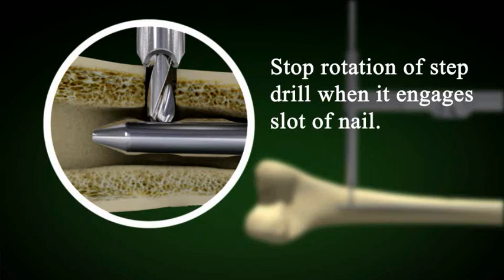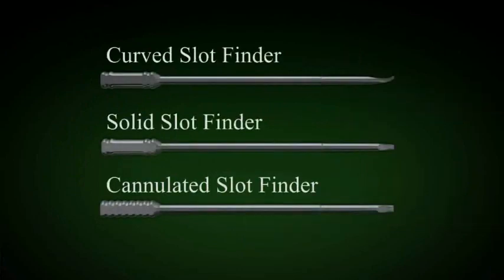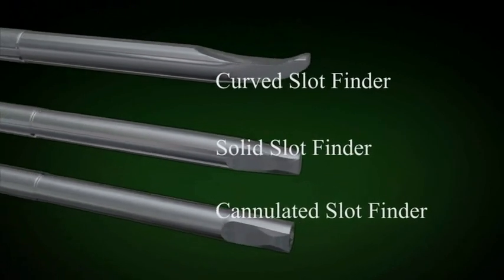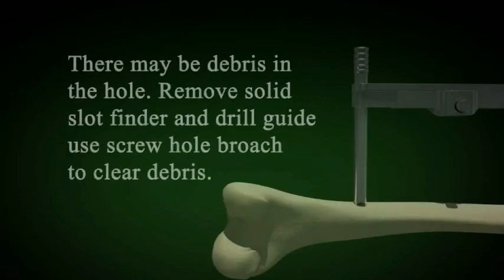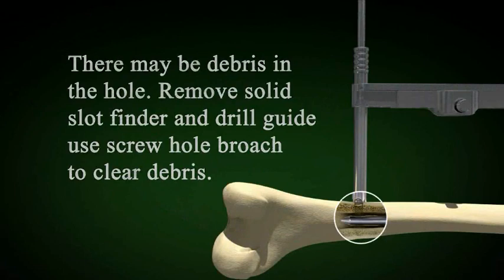We have three slot finders: the curved, the solid, and the cannulated, and each has a specific use. Sometimes after drilling the hole and using the step drill, there is debris in the hole of the cortex. This is removed using the screw hole broach.